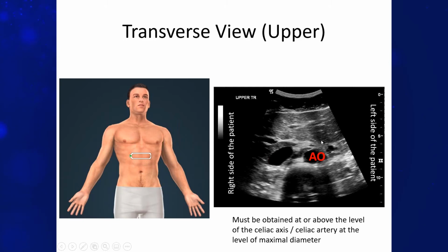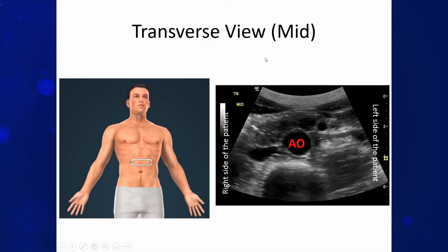And so anteriorly, you should see the liver. So we know that, and also make sure your depth is adjusted well, so you're able to see the structures without cutting it. This is the view to the mid-abdominal aorta, and in this level, you will definitely see aorta in the spine, and just measure outer wall to outer wall. If you do see an aneurysm or dilatation, you want to also measure side to side, because sometimes the diameter could be much more on the side lateral aspect as compared to anterior posterior, and the management is based upon the maximum diameter that we get.